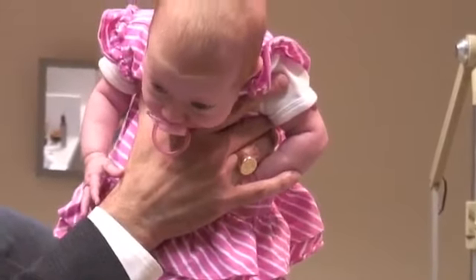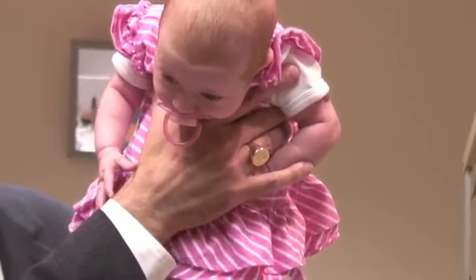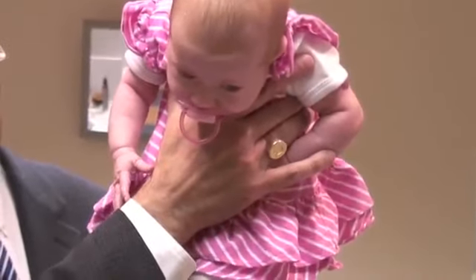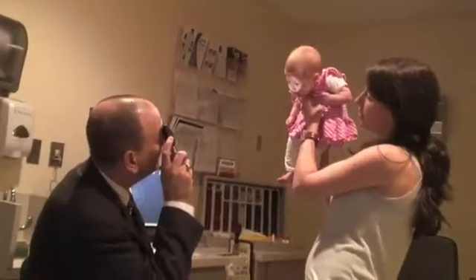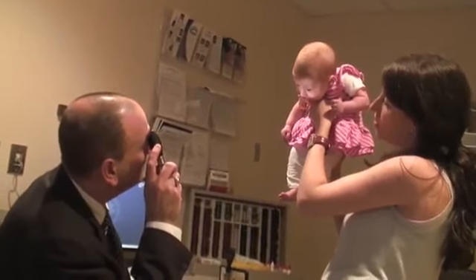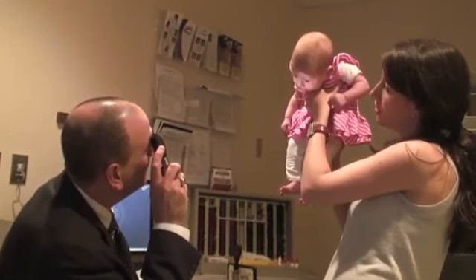With infants, getting the child's eyes open can be a challenge. Hold the child in this position at 45 degrees with one hand on the chest and the other hand on the baby's buttocks. By jiggling the buttocks, the eyes will open. You can teach the mother or father to hold the baby in this position while you do the red reflex test, thus allowing you an unobstructed view.